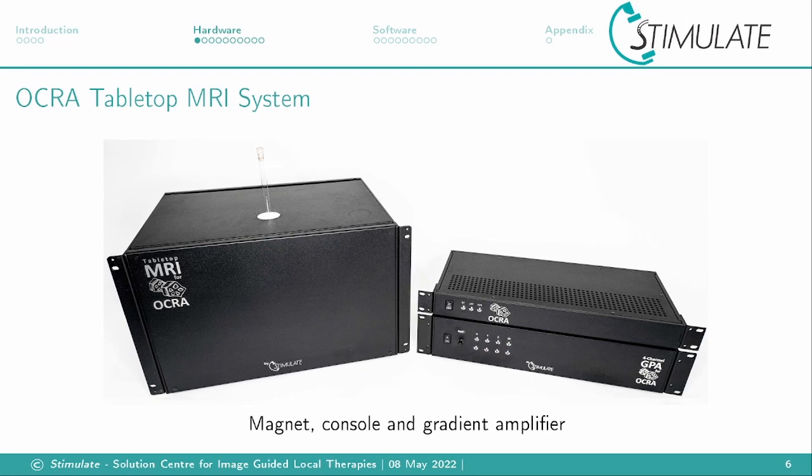This is our latest state for our OCRA Tabletop MRI System. On the left hand side you see the big magnet box with a permanent magnet, where the chemical test tube sample gets put in. On the right hand side you see the OCRA console and below the gradient amplifier.